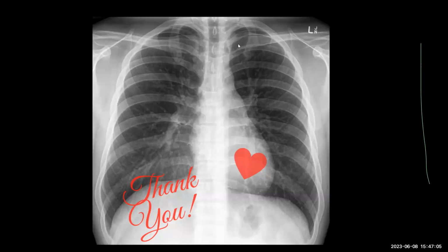Thanks for the question. I think the problem is dynamic MRs are done on specific scanners which are meant to scan the patient in a sitting and standing position. So you cannot usually do these on a static MR unless you have a trade-off where you do a scan with the patient supine, then flexed and then extended.